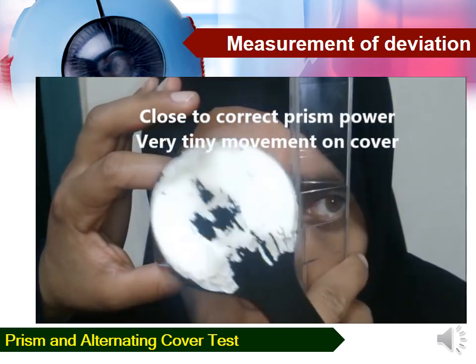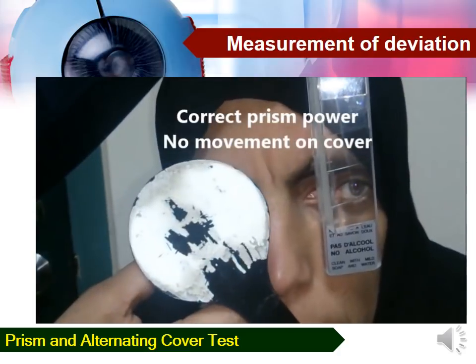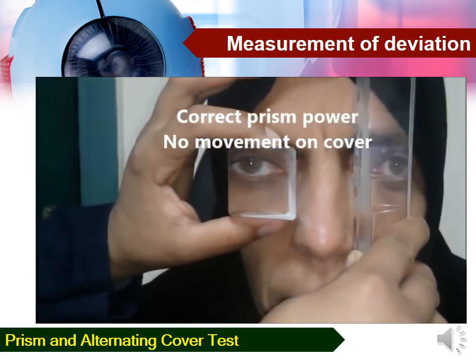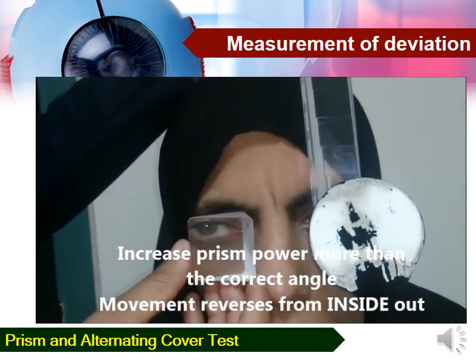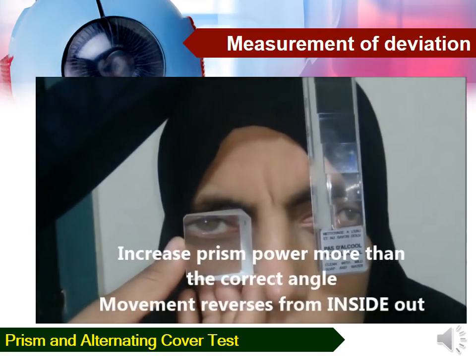As we approach the neutral point, the movement is decreasing until you reach the correct prism power where there is no movement on alternating cover test. Now, if we further increase the prism power, you notice that the movement will reverse from inside out, indicating that you exceeded the neutral point.